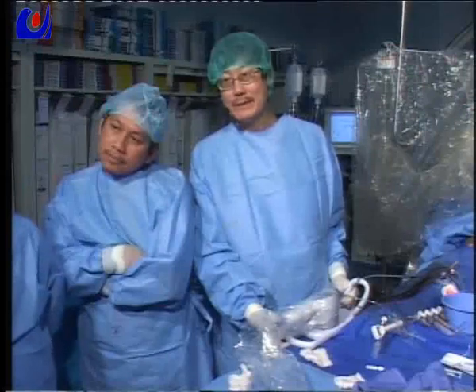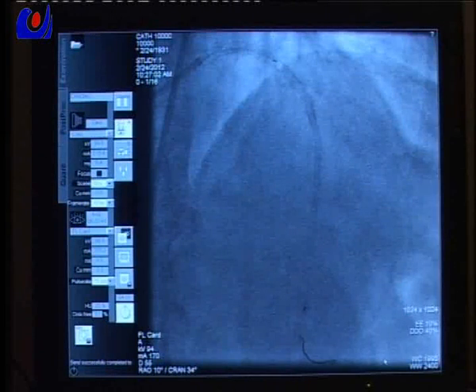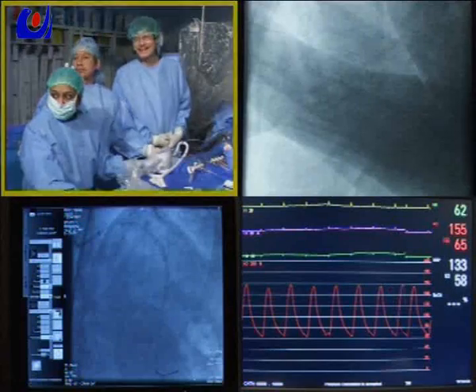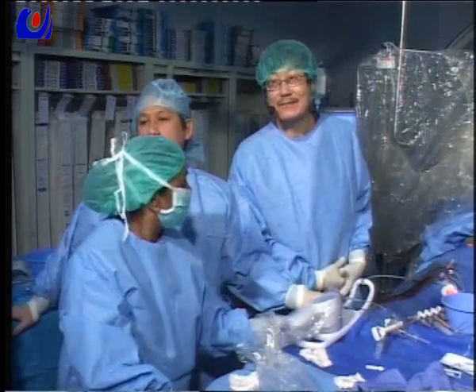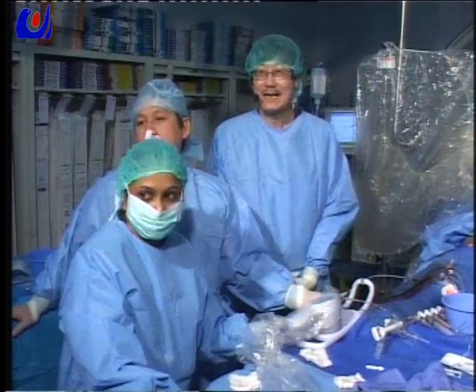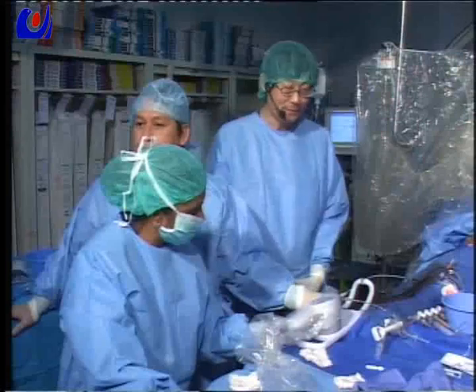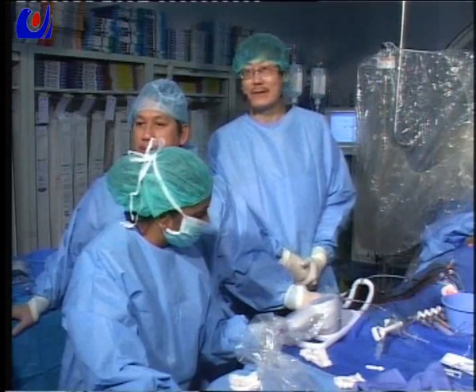Okay, I'm happy with this one. This is a proximal RCA. Yeah, very good expansion. Very good deployment. Okay, this is a bifurcation. Looks okay to me. I feel it's okay, and because it's kissing balloon inflation, the left main becomes overshaped. But the minimal stent area should be large enough, and we are covering to the orifice. Yeah, this is the ostium of the left main.